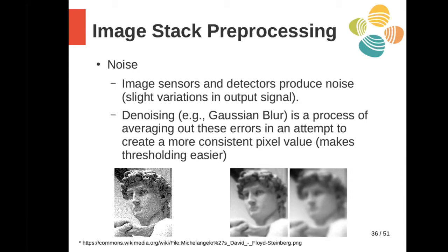It may be hard to threshold based off just a particular intensity value. Theoretically, the images that come off a CT scanner are all about density, and different materials have different densities. You should just be able to threshold the densities out and you're done. But the noise makes it trickier to do that.